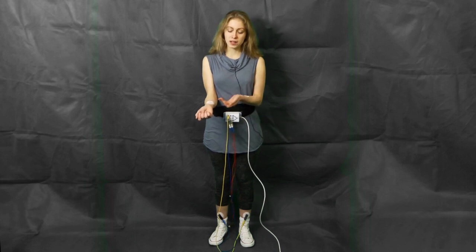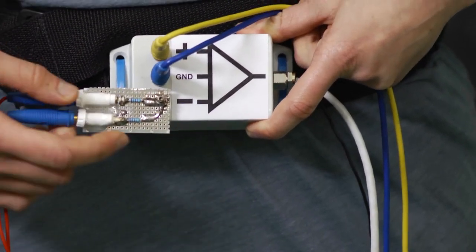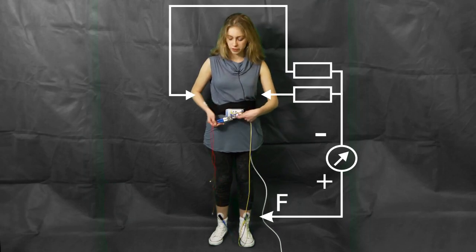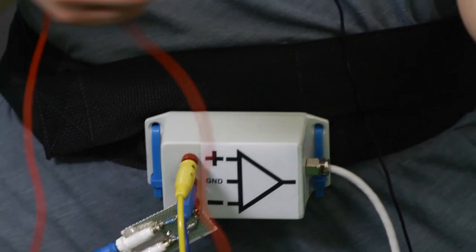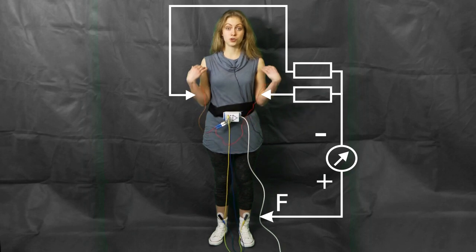What we do here is that we simply use the electrodes on my arms again and connect them together with our two resistors here, resistor 1 and 2, which are both connected to the negative input of the amplifier. So let's do this here. There we go. So this connection, in turn, creates this virtual electrode between my shoulders. So there is no need to place a new one. We simply use the same electrodes as before on both my arms and foot.